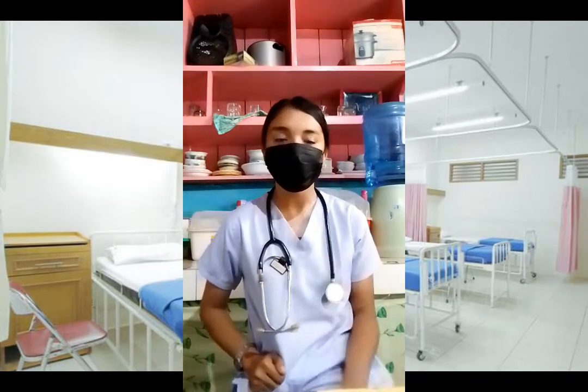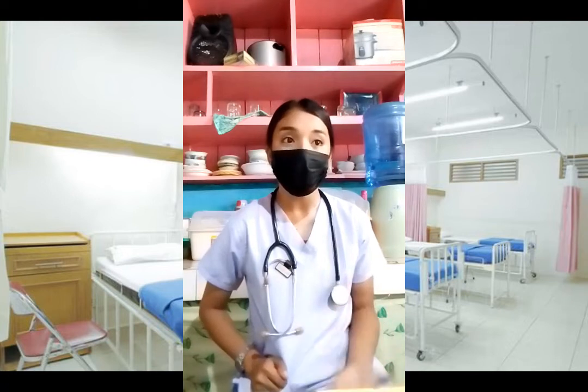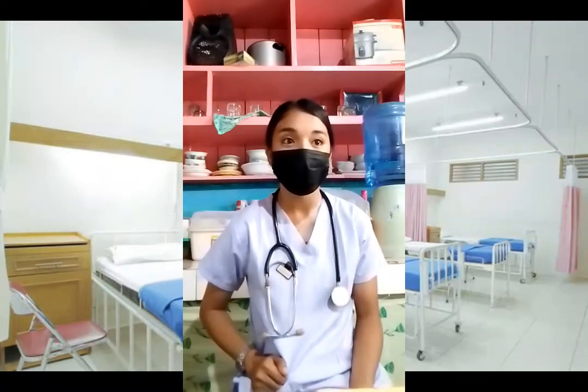The next procedure that we need to perform is the catheterized urine specimen collection. The definition of this is collection of urine specimen from the catheter. The purpose of this is to obtain sterile urine specimen for microbiological analysis, and the materials and equipment are a sterile 10 ml syringe with 23 or 25 gauge needle, non-sterile gloves, alcohol swab, a sterile specimen container, container labels, and catheter clamp.